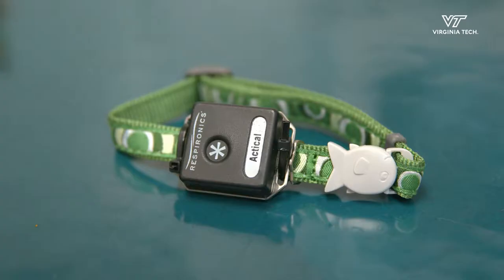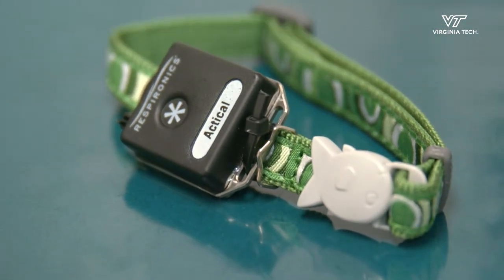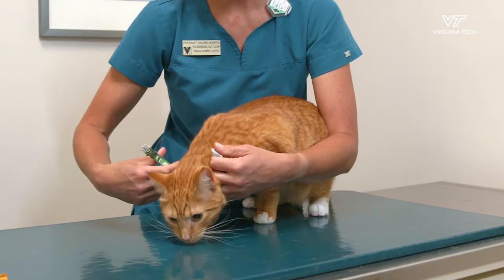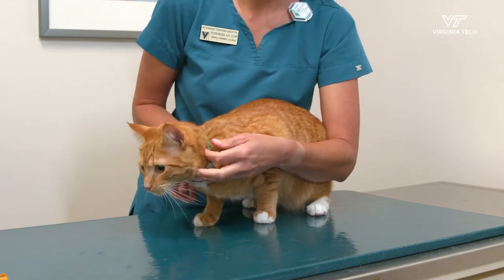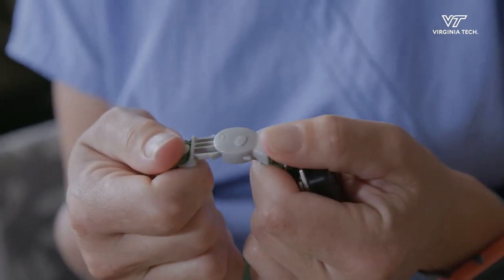First we have the activity monitor. The activity monitor is attached to a common cat collar. You can adjust the collar if needed as it can be a little heavier and bulkier with the monitor attached. It is a breakaway cat collar so there are no clamps, tabs, or buttons to push. To take it off you simply pull the clasp apart with a little force.